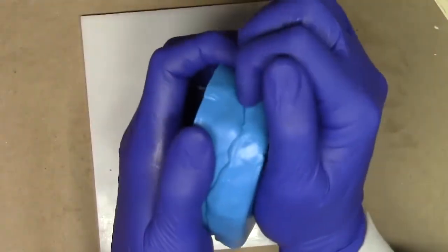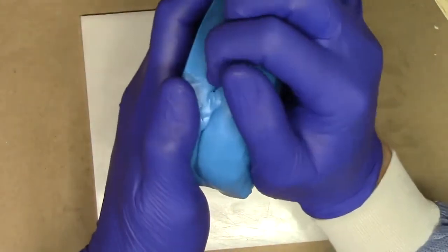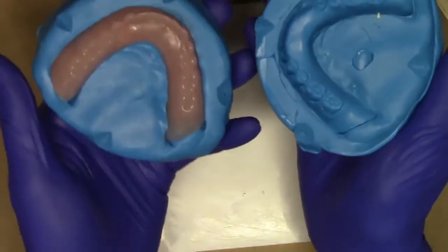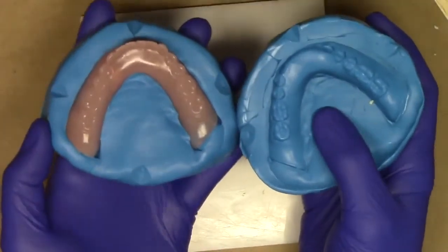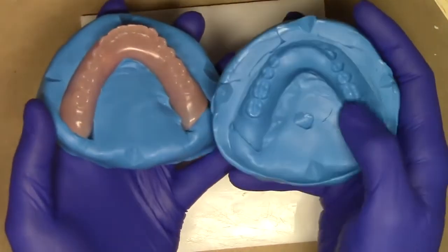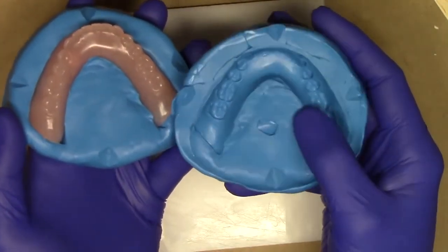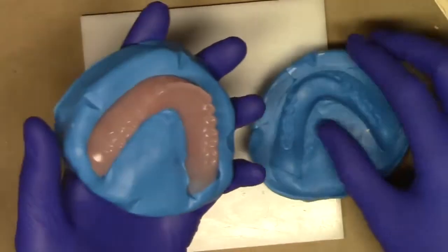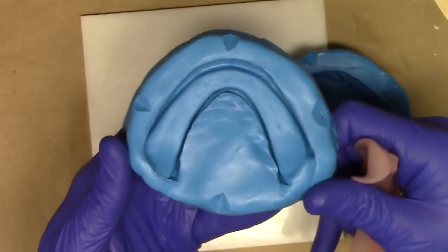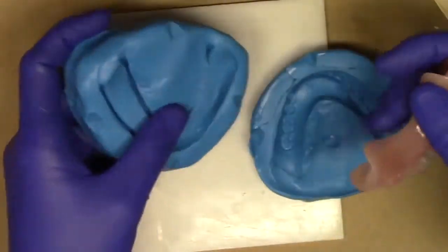Now we're going to go ahead and do a separation, just gently teasing from each corner until fully separated, just like so. As we see here, what we're doing is inspecting the intaglio surface, or the underside of this putty impression material, verifying that we've got completely adapted all the way around the occlusal surfaces as well as in the facial. Same thing in here. We can separate the denture from that portion of the putty, verifying that we have a very nice looking tissue ridge conformation.